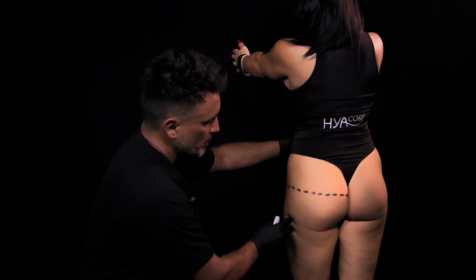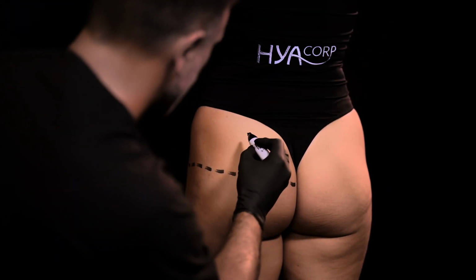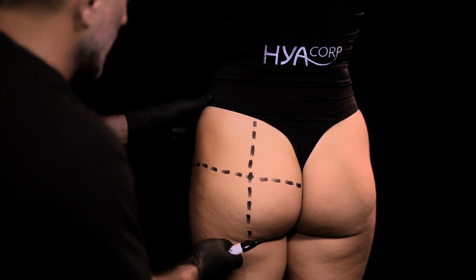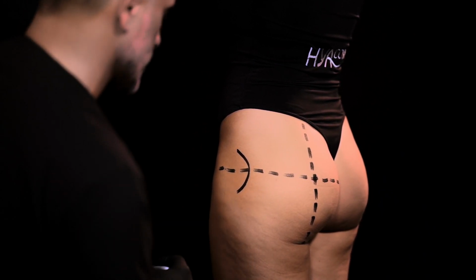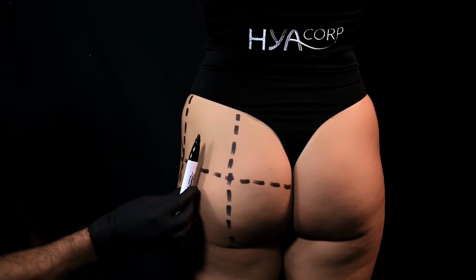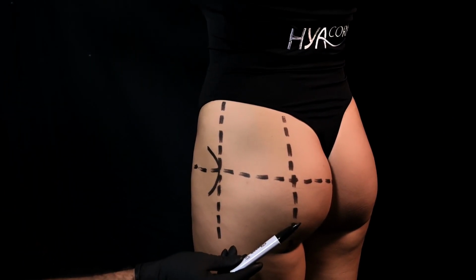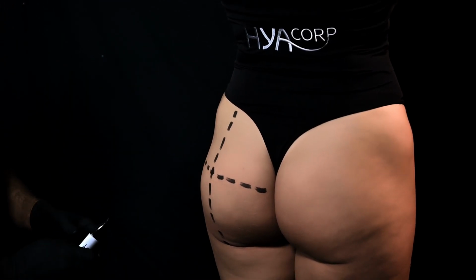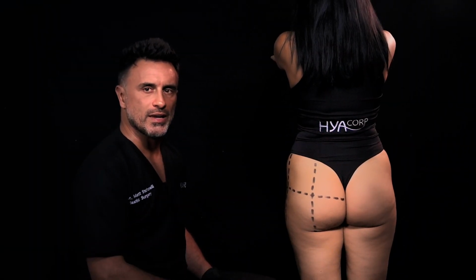So this is the first line, and the second line will be vertical, the half of the thigh and the butt. Finally, I will place a third line corresponding to the great trochanter. Here you have the great trochanter, and we are able to draw this line. You can appreciate the difference between the medial butt, lateral butt, and really the hip region. On this view, you can see that she has a good projection. She doesn't complain at all from a butt projection, but on the back view, she's complaining of this mild degree of hip dips.